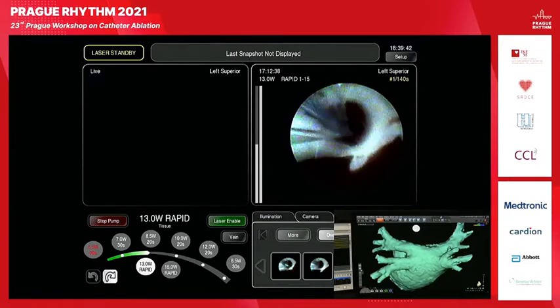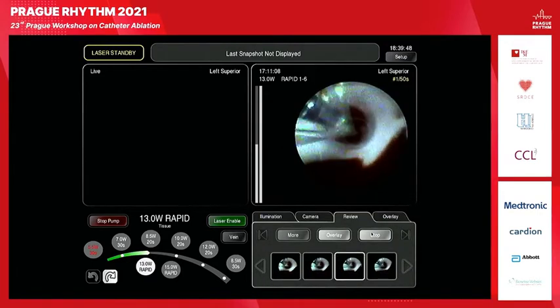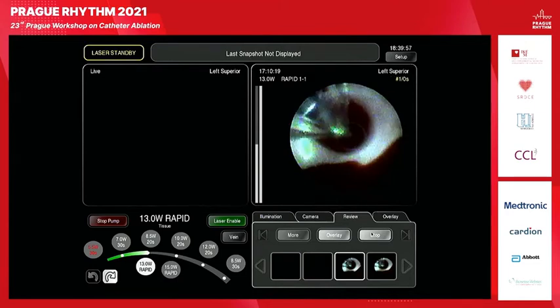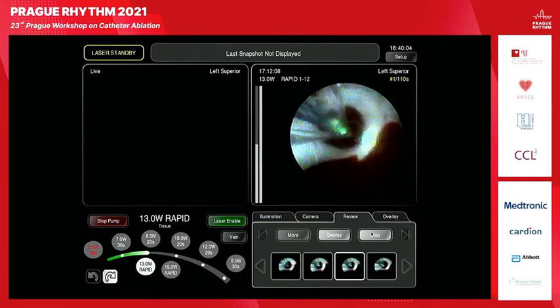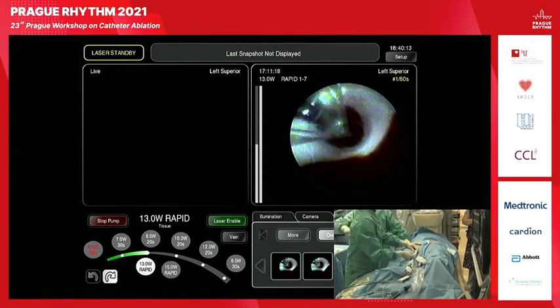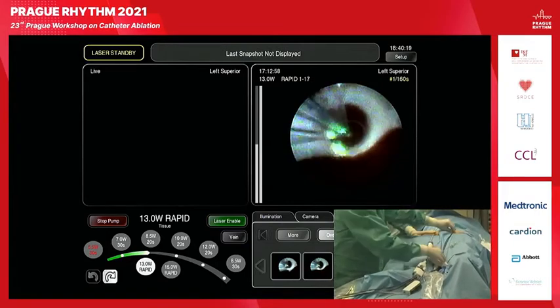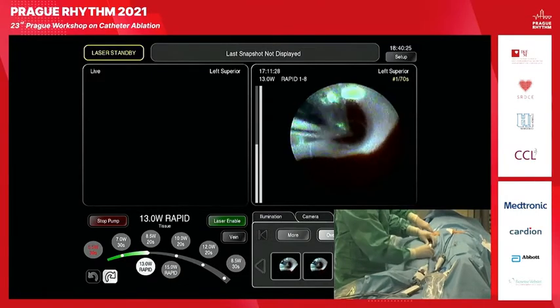In the left vein, you can see on the right side not only the ridge, and sometimes, depending on the sizing of the heart, you can even visualize the appendage itself. So, what we are doing here in Homolka, it's not always the same technique, but we like to get all veins isolated, to get around. Somebody is going only for the left set of veins together, excluding the carina in between the veins. So we can go to the left inferior.